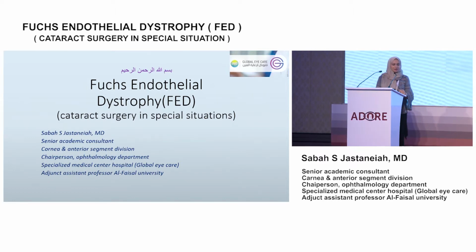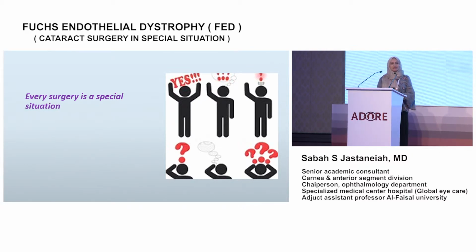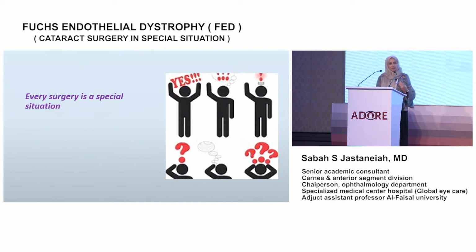After all those beautiful talks, we're just going to talk about cataract surgery in a special situation, and I'm going to be talking about Fuchs. Basically, as this is a resident sitting, I would advise everyone, whenever you're starting your phaco, to start it as a special situation. If you get used to dealing with your daily phacos as a special situation, then you will not have any problem dealing with real special situation cases.